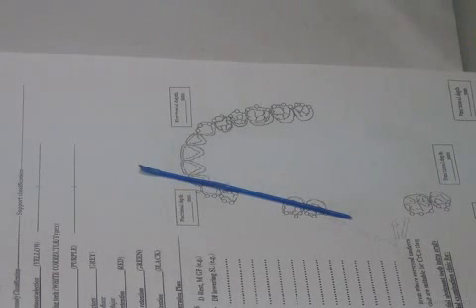I need 2 clasps. I have 2 clasps here. I need 2 clasps here. I need that support to go to the other side as well. I need some reciprocation from the other side and stabilization. So I do extend to the other side. Okay? What about the tooth below?